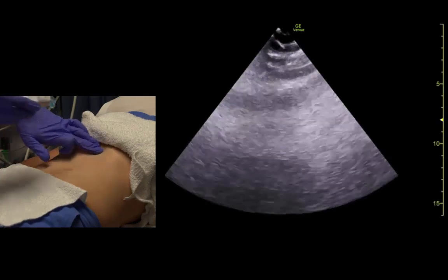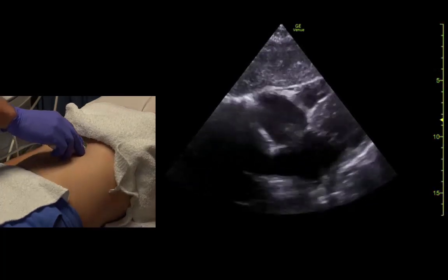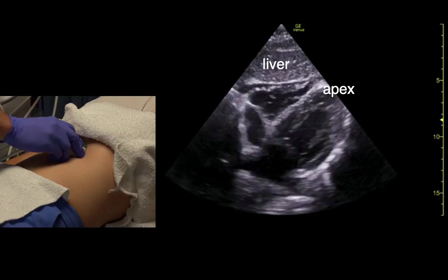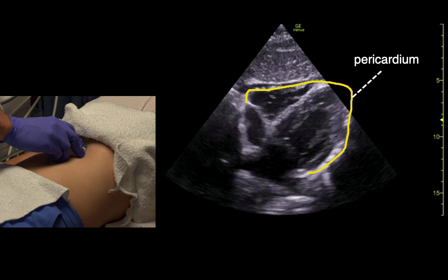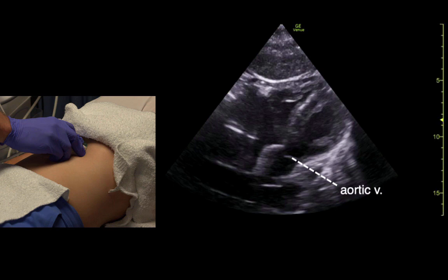Let's do the sub-xiphoid heart. The indicator is towards about three o'clock. We come under the xiphoid and ask the patient for a big breath and hold. We get a pretty good view of the heart here. Sometimes if you flatten the probe, you can also see the aortic valve from this view.